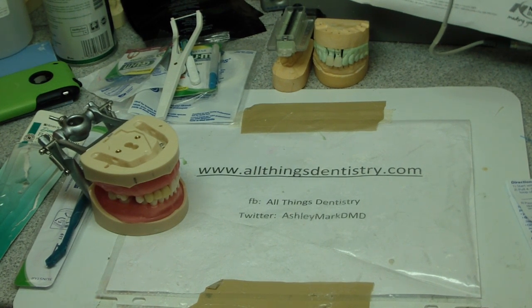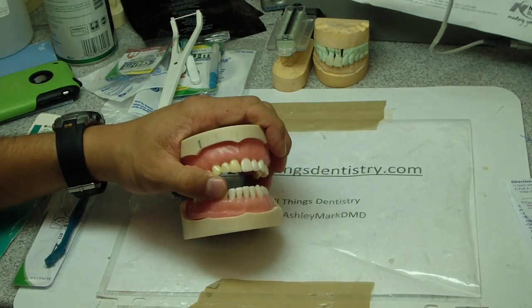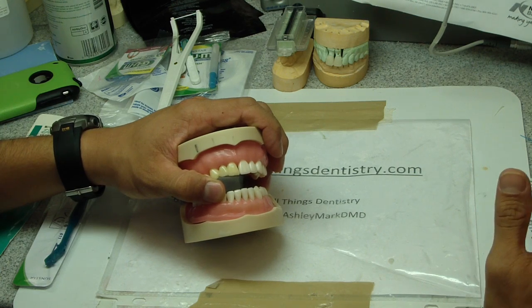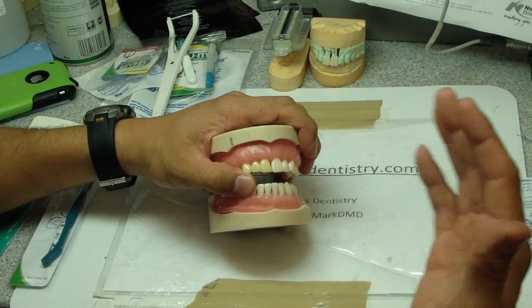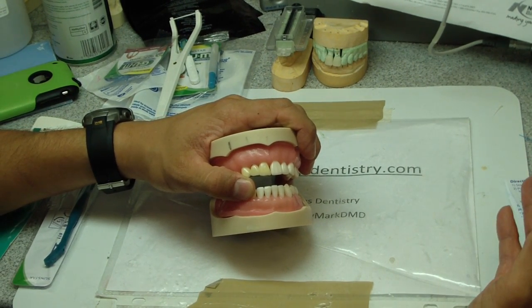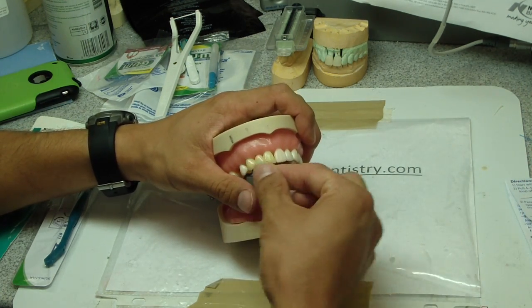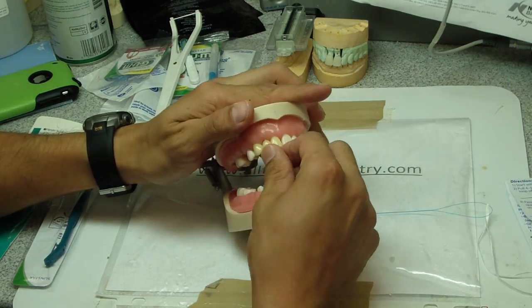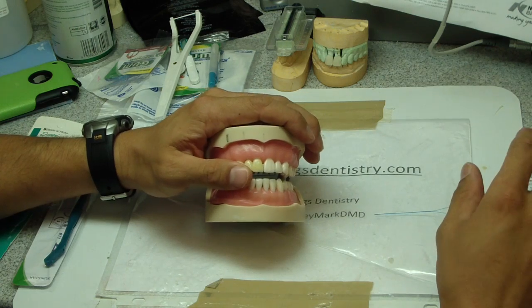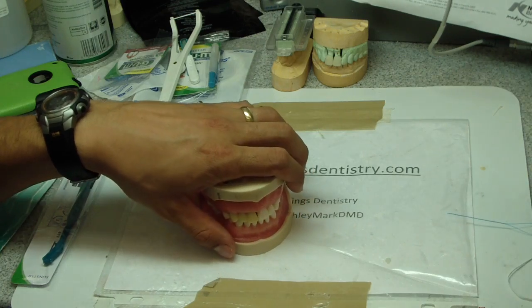Hey folks, Ashley from AllThingsDentistry.com. I want to talk about cleaning and hygiene with bridges and FPDs. You can use this for your patients. I had a patient today who was sedated and I dismissed her without having an opportunity to discuss hygiene — she would have forgotten anyway. So I'm making this video for her, but we'll share it with everyone. Here's an anterior FPD with a single pontic, and we're going to go through five or six tools — there are probably four billion different tools, so let's just go through the basics.